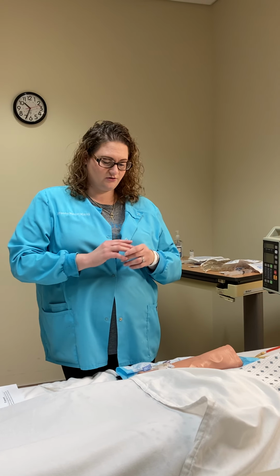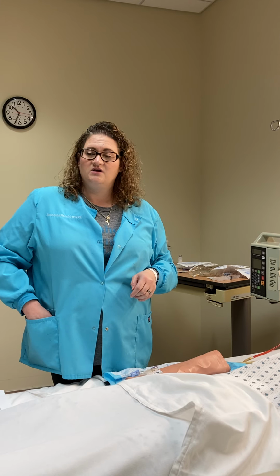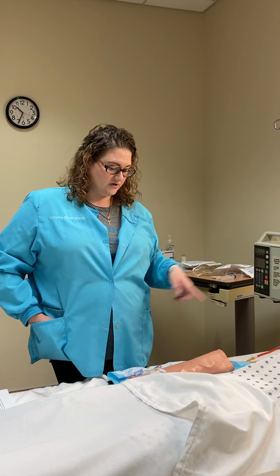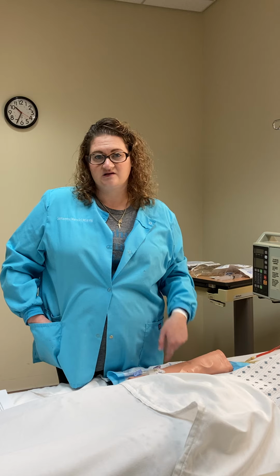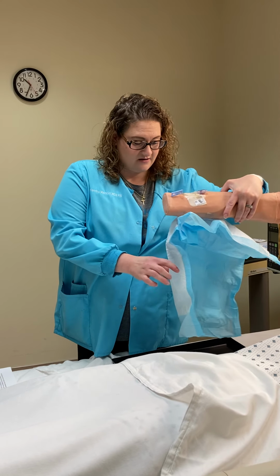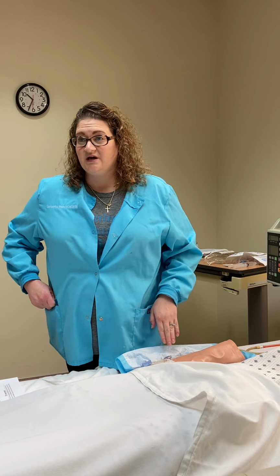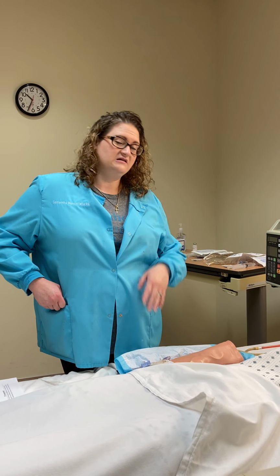Then we will go through setting up a primary line, giving an IV push both through a line and just through the J loop, this is our J loop. Setting up an IV piggyback with a primary line, and then an IV push just straight through the J loop. And then discontinuing our fluids to convert it to a saline lock.